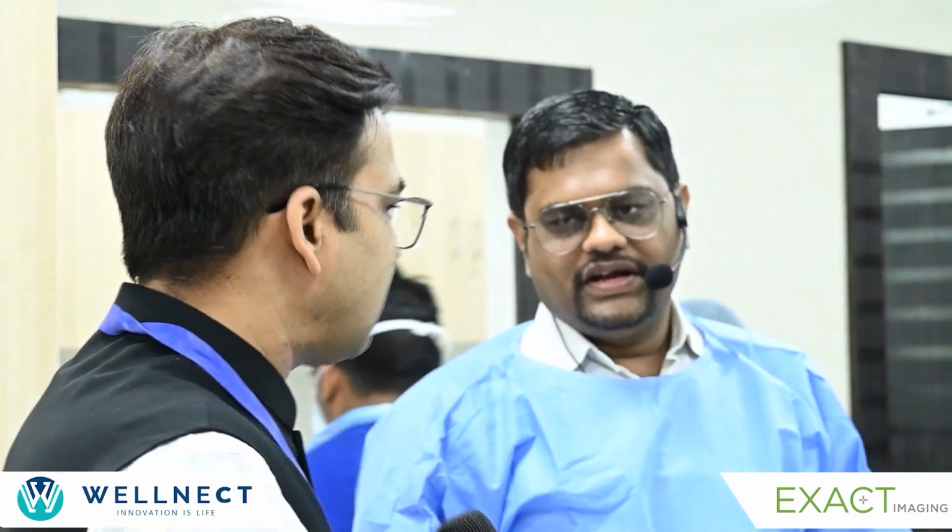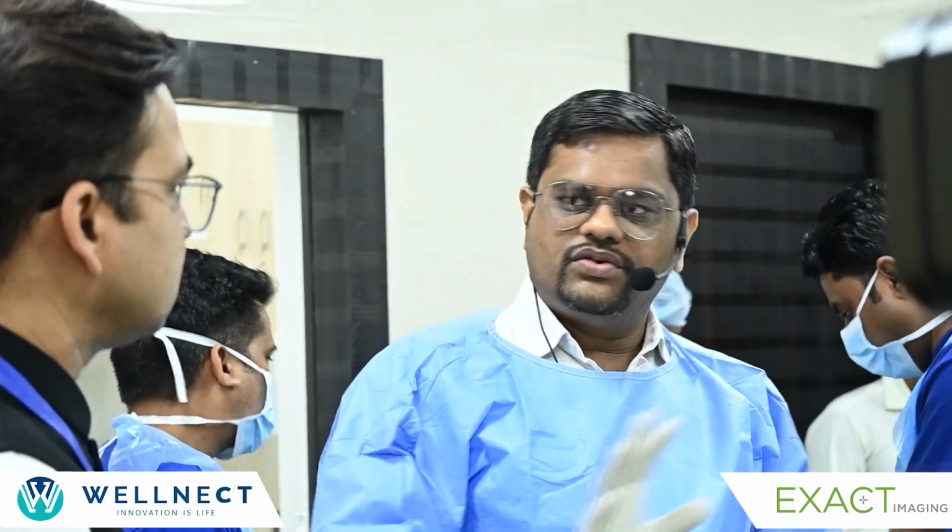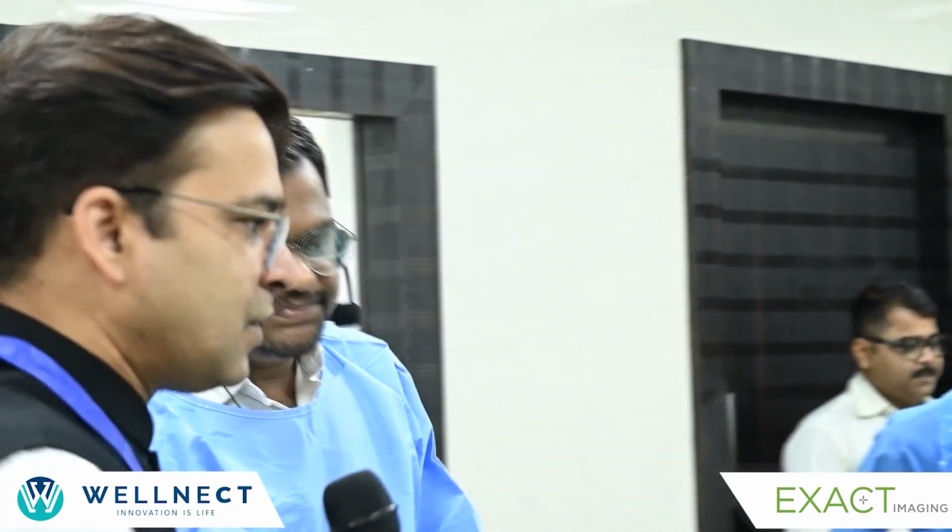It helps the patient. And the last point you made is, you see the patient was comfortable and allowed a proper biopsy of 12 to 13 cores just because he was given a prostatic block. So this is a very simple thing that you could have done. And with prostate blocks, even mild sedation, you can do an office transrectal biopsy. Thank you everyone.